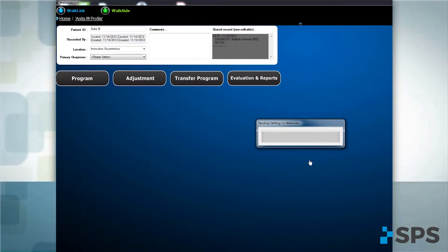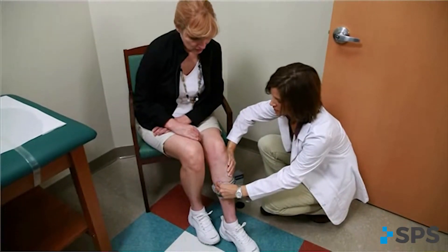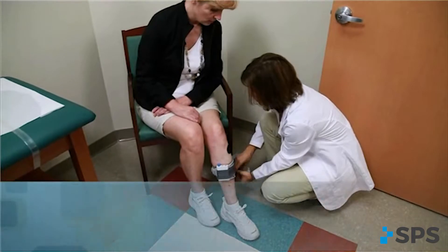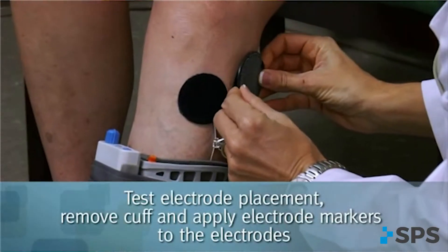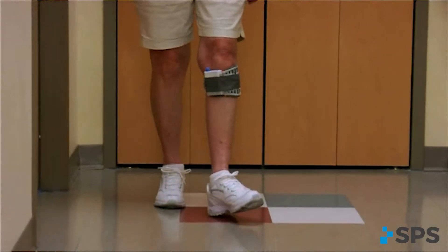Set up the patient's WalkAid and confirm that electrode placement, cuff fit, and program are correct. Use the electrode markers and demonstrate how to change and connect electrodes.